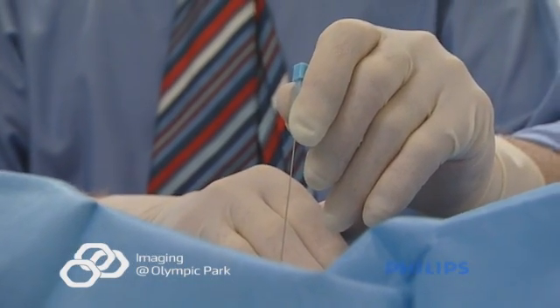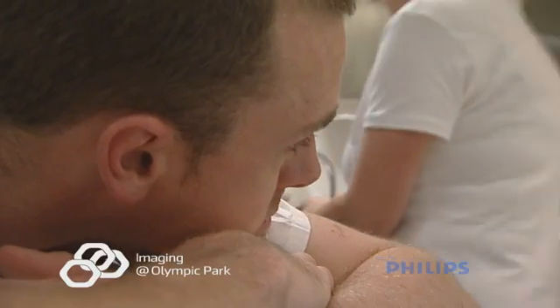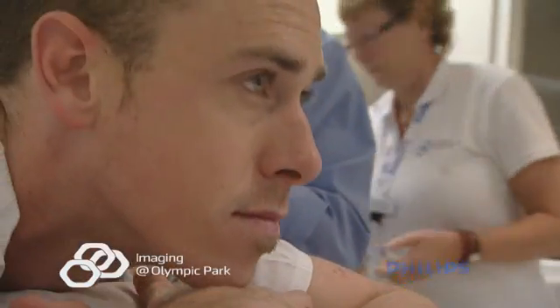Infection control is important to us and we make sure the procedure is done with a sterile technique. Our facility and technique are compliant with and have been approved by the Department of Health Services.